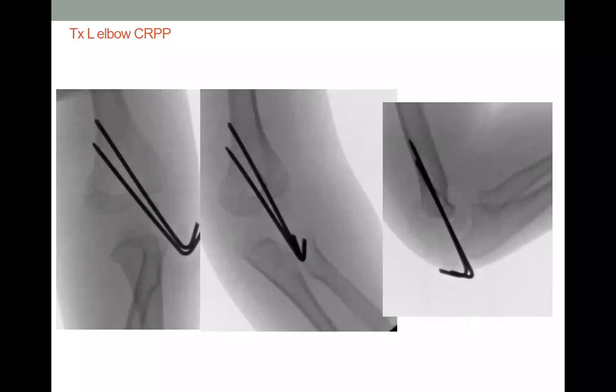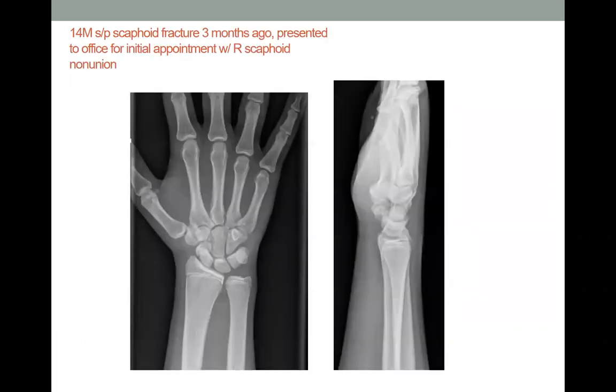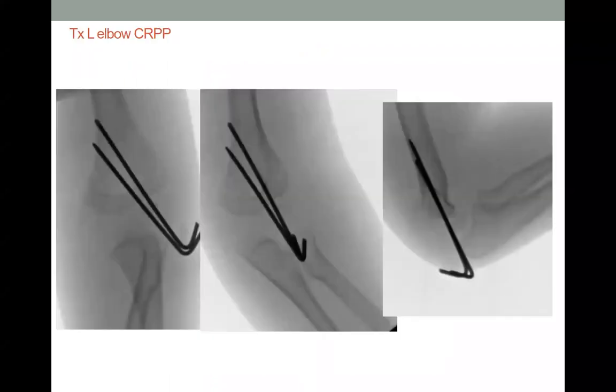You said this is a 2-year-old? 2-year-old, yeah, not a lot of windows. There's not a lot of room, and if you wind up making multiple holes, then, you know, how much spread do you want to have usually? Usually you try to get about 30% across each column, about a third of the fracture site. The closer they get together, the more they function like one pin, but at 2 years old, probably fine. Yeah, it was stable on exam.